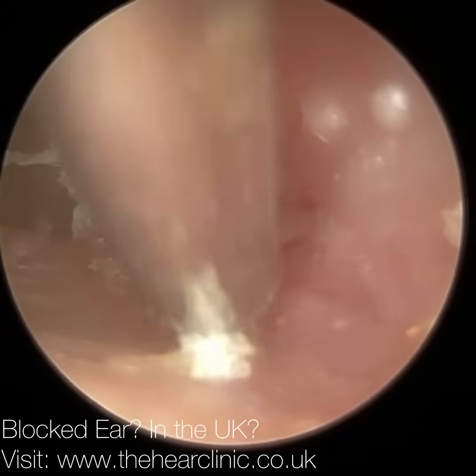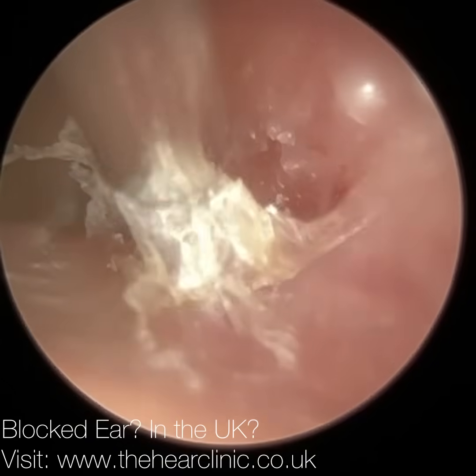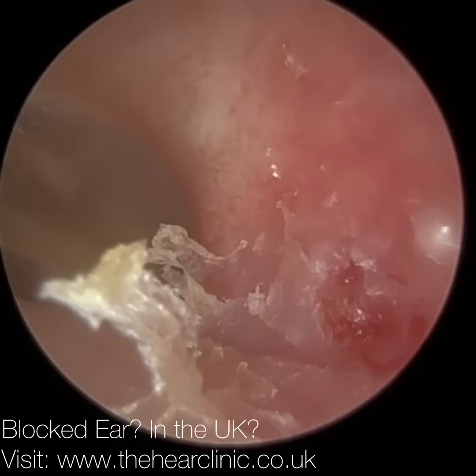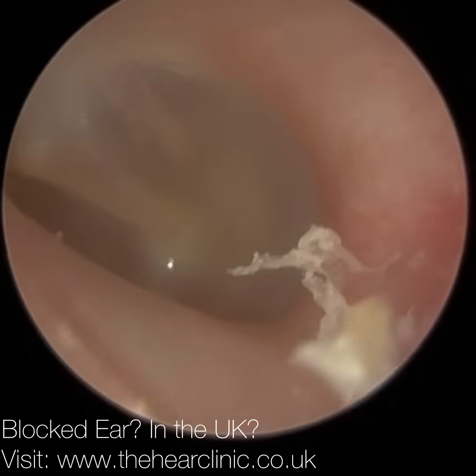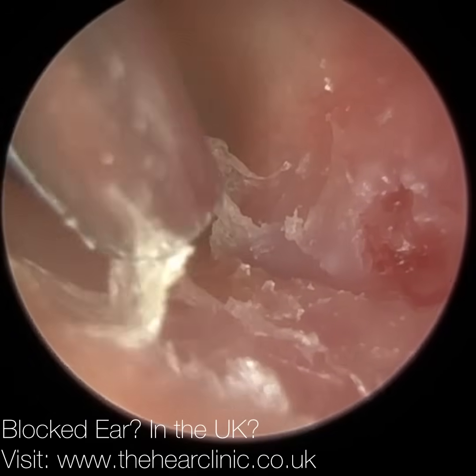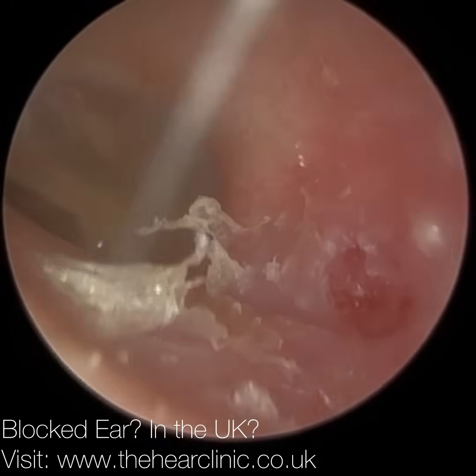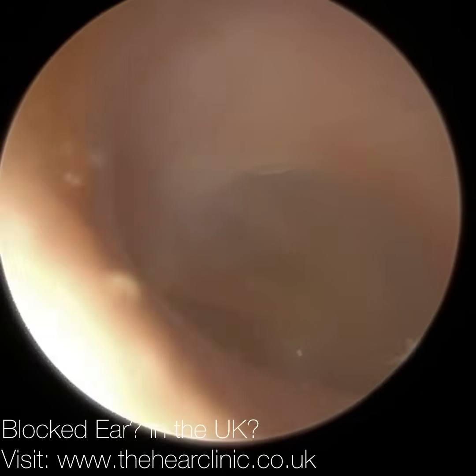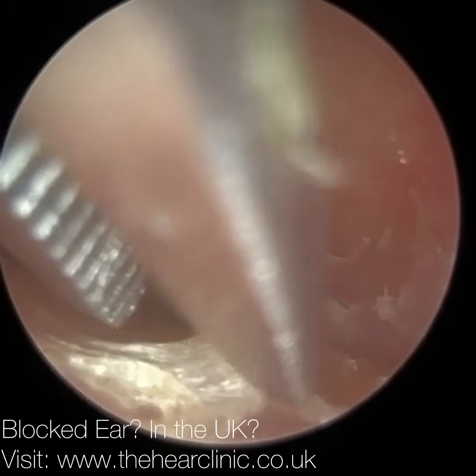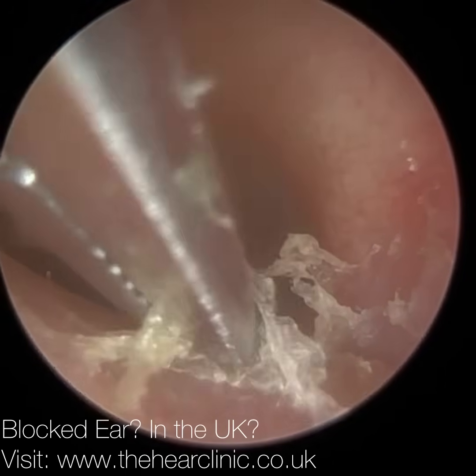Now this could be a case of pressure necrosis — that wax is quite hardened. If you watched yesterday's video with the deep ear pits, I do explain in detail the different pathologies that might cause erosions and widenings, particularly at the floor of the ear canal — some of them being benign osteonecrosis, external canal cholesteatoma, or keratosis obturans. This is not keratosis obturans; this is very localized. So you just need to get this referral done. There's no discharge. So it may be an early stage external canal cholesteatoma — stage one. Stage two is when it's ulcerated.